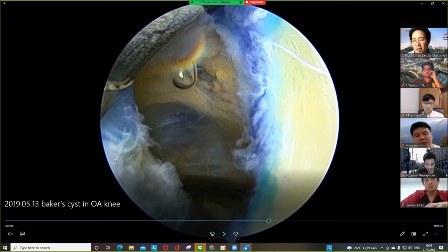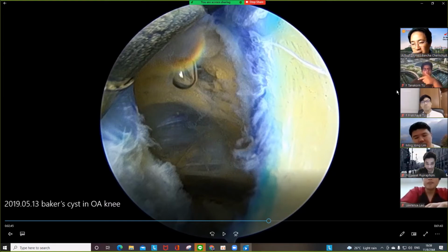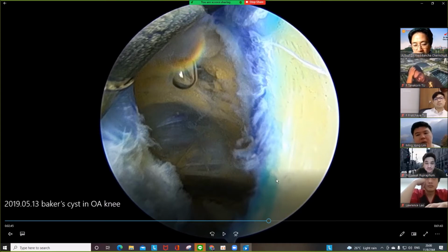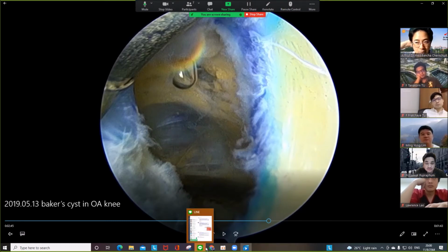Yeah, that is gastroc. Gastroc will be more central because your portal is coming from medial, right? Right hand side is medial, left side of the monitor is the lateral or central, right? This is central. So identify this, and you need to make this clean and wide. Okay, so that's important to see this. You need to see that this is gastroc, this is semi-mem. Okay, this triangle and all the cyst wall was already removed.